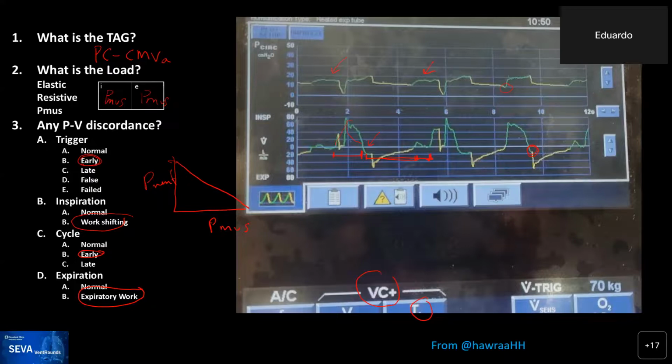And there may be other modes. If the patient is having periods of apnea, then as Ryan puts it, there may be intermittent mandatory ventilation strategies that may help you. It could be type 1, type 2, or even type 3 IMV. There are several modes that can help with that.